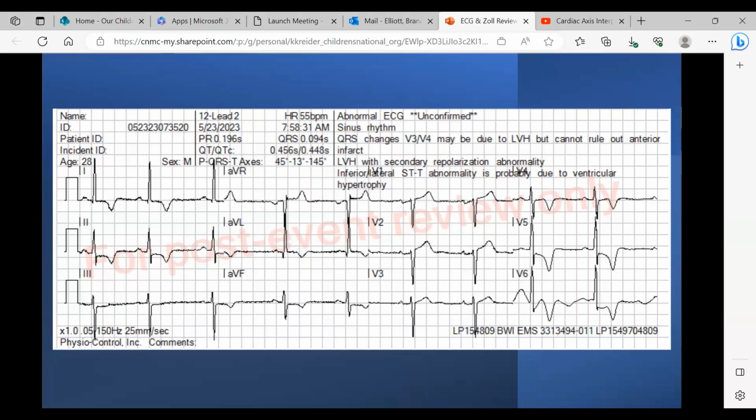There's something bad going on. Yep. So it's a precursor to a complete heart block, and that's how you kind of predict that. I do have an example of one later on, and that 16-minute video exactly explains that process. It is the base of the cardiac axis, let alone the issues of the bifascicular block, which is a lot to compute the first time around. But yes, we have an example for you as well.